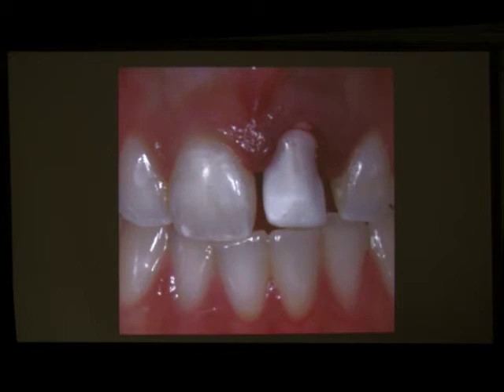So if at some point your torque starts to go high, and when we mean high, it means not more than 40 newtons with this central incisor. So when we are close to 35 and we are doing 180, we have to stop and check where we are. Can we go deeper because we are still too much supragingival? Yes. Do I have room for the torque? Yes. I do 180 more. Sometimes waiting gives you more elasticity on the bone, and you are able to place the implant once again 180. Of course, in the front this is important.